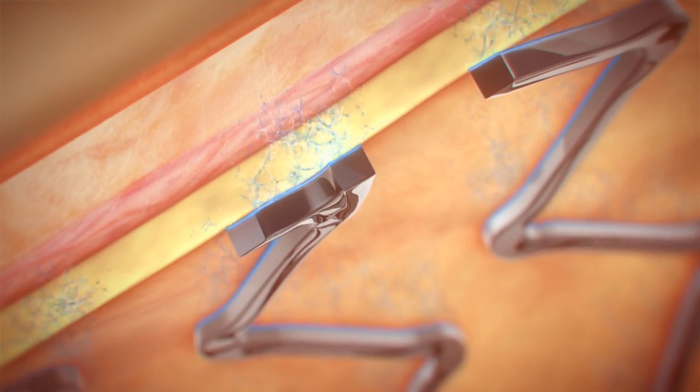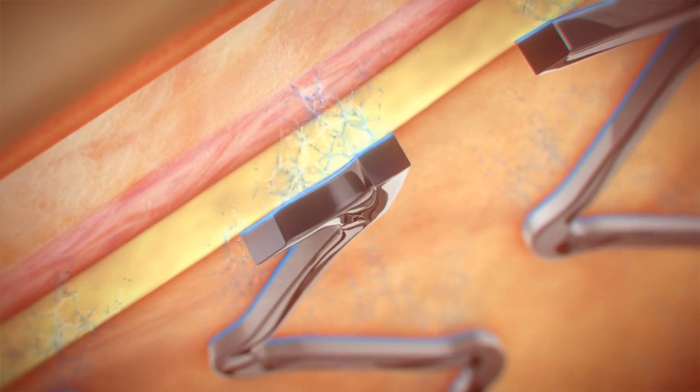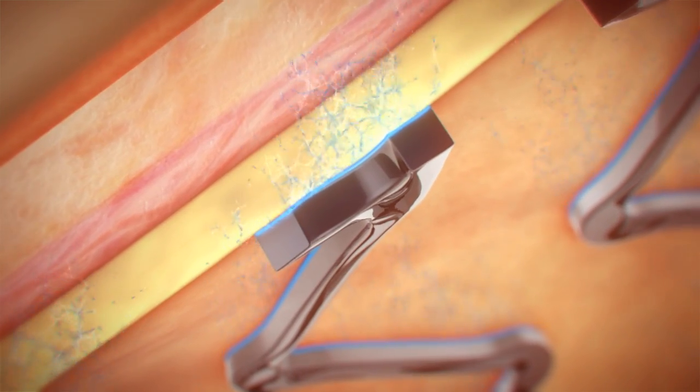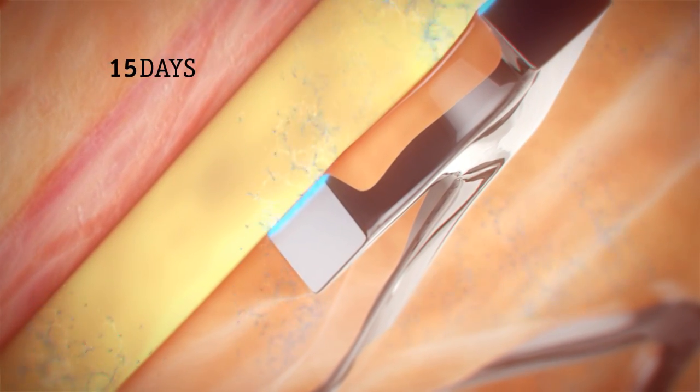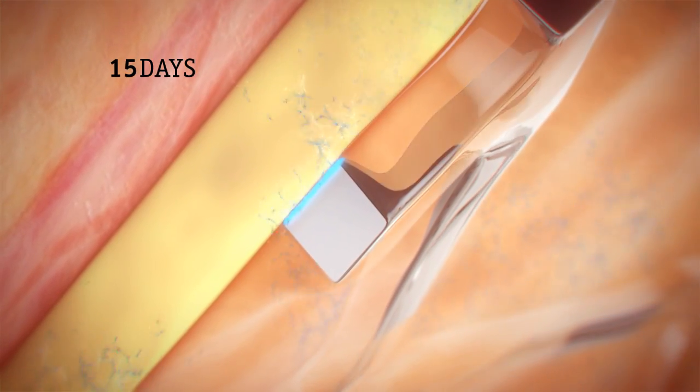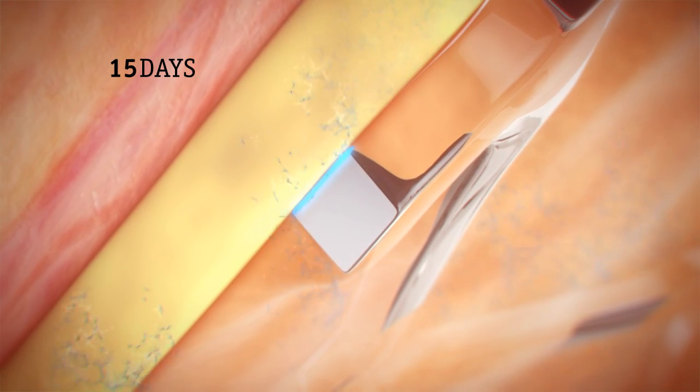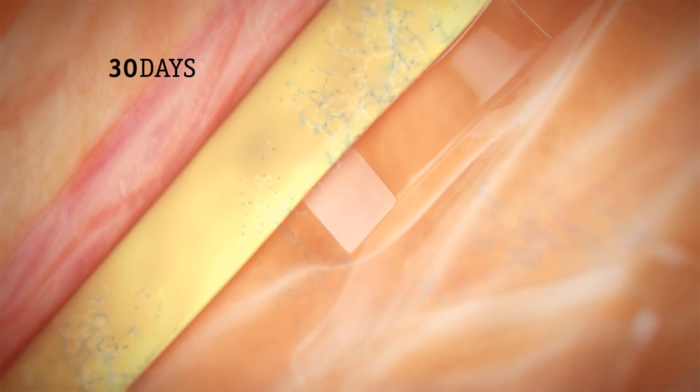This unique coating is applied only to the abluminal side of the stent, while the lumen side is bare metal platinum chromium. The abluminal coating design prevents cell proliferation within the smooth muscle cells, while promoting healthy and rapid endothelialization within the vessel lumen, allowing for early healing.